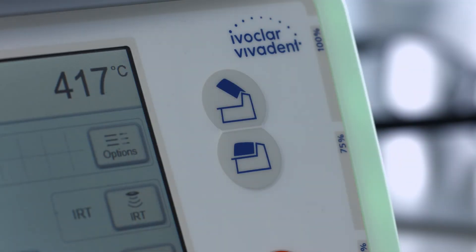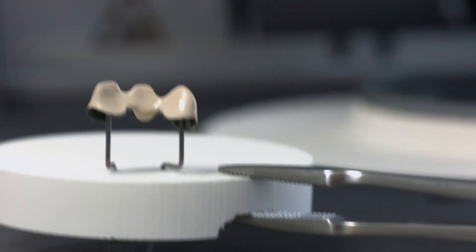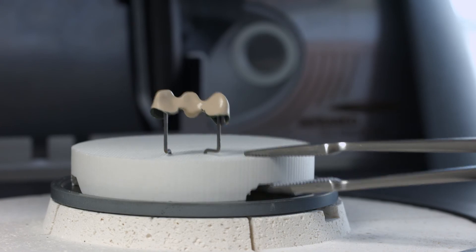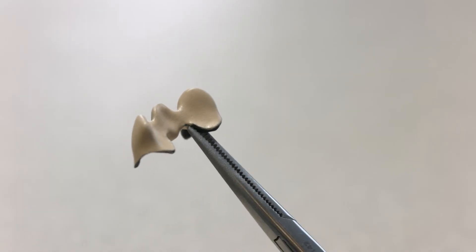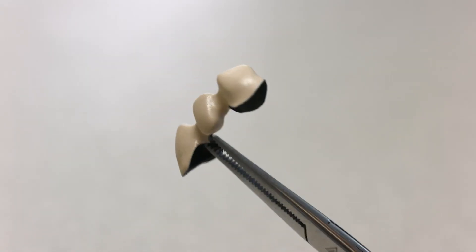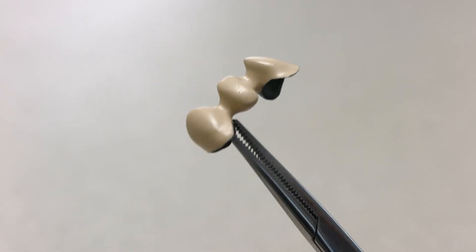Now, fire the second opaquer layer. After firing, the IPS style powder opaquer should have an even, silky matte appearance.